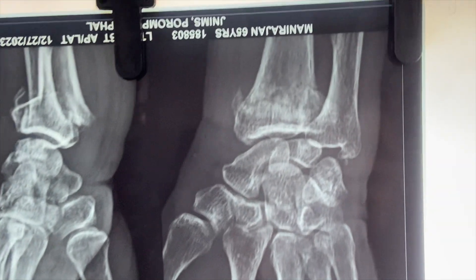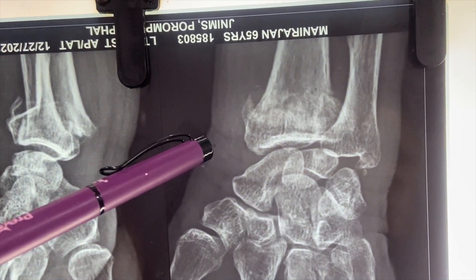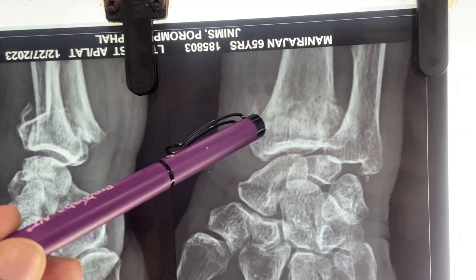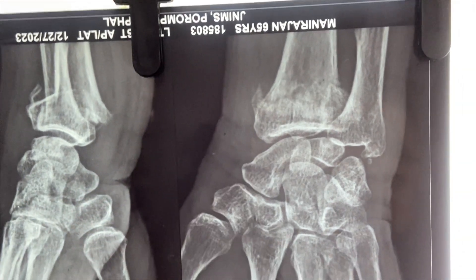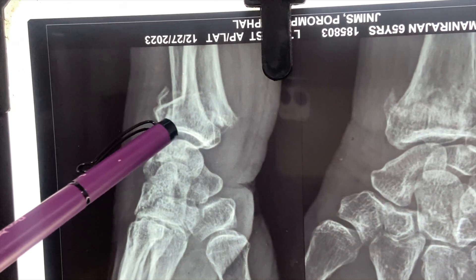This is a wrist x-ray of a 65-year-old lady showing a corticocancellous junction fracture over the distal end of radius, with loss of radial height and radial angulation in the AP view, loss of volar tilt in the lateral view, and dorsal or posterior displacement.